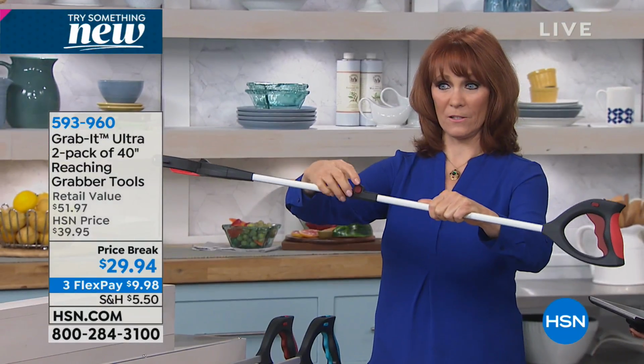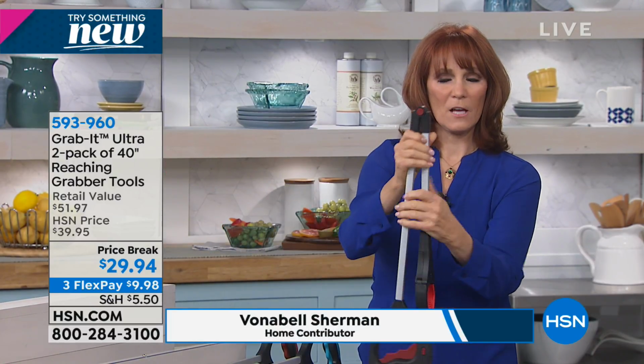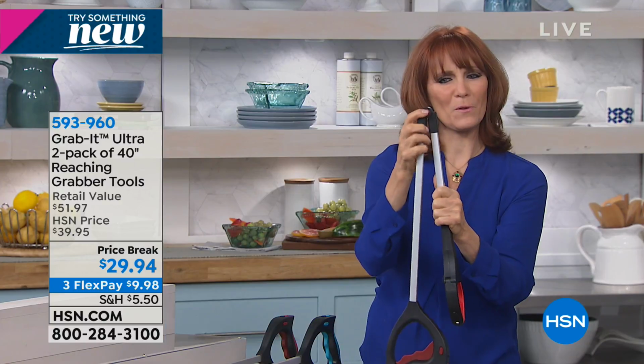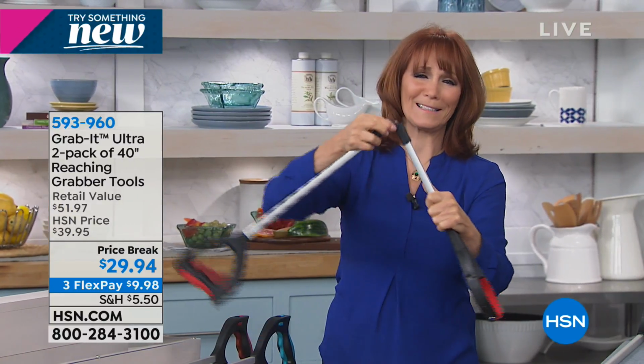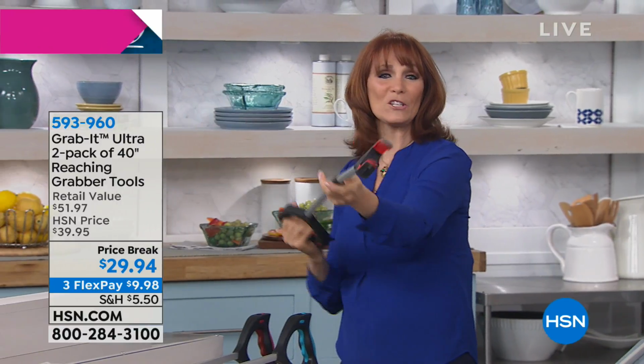So there's a button here. Oh. So all I do is I press that button, and then I fold it. So when you're going to open it, please remember, a couple of people said, I broke it because I didn't push the button, so please push that button. And then you're ready to grab.